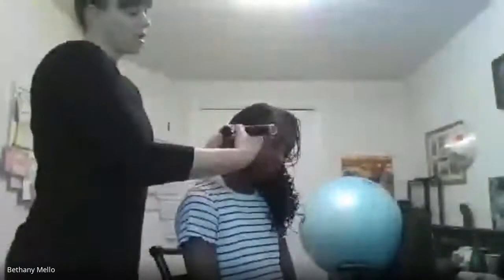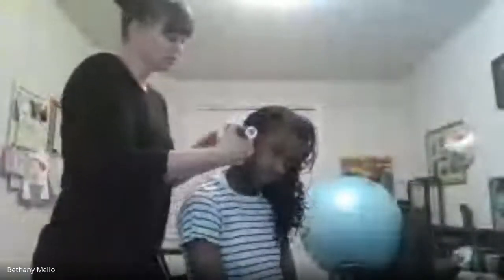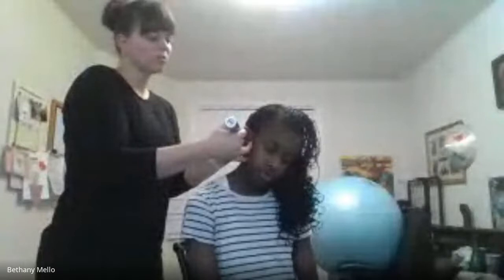So one method is to hold it upside down like this, like a pencil. And then these two fingers are going to go against her chin here. You're pulling up and back, and you're supporting. Notice how I'm just turning a little bit here. Notice how my fingers are on her face. So as I'm going in here to look, if she moves, go ahead and move. This is not going to go any further than where I put it because my fingers are here, not allowing it to jam in there, okay?